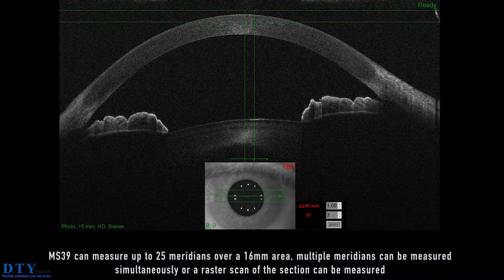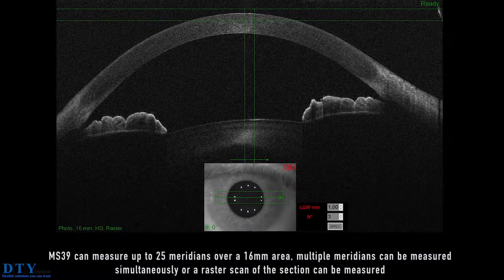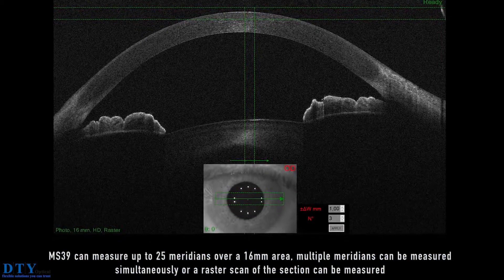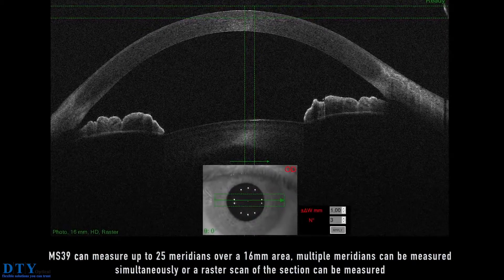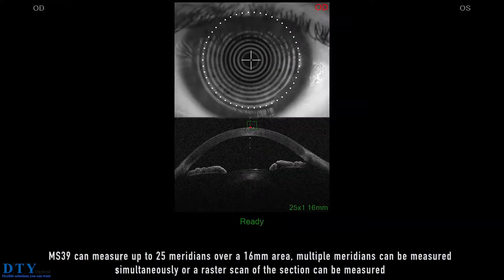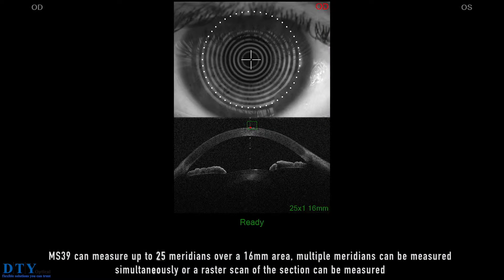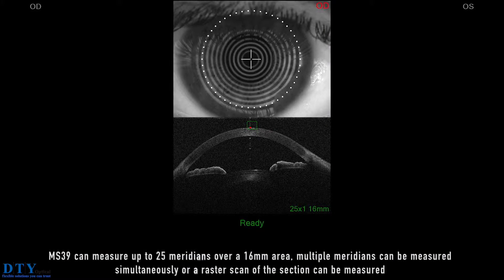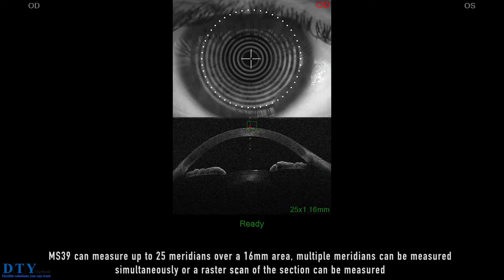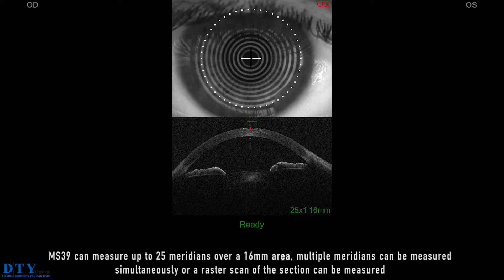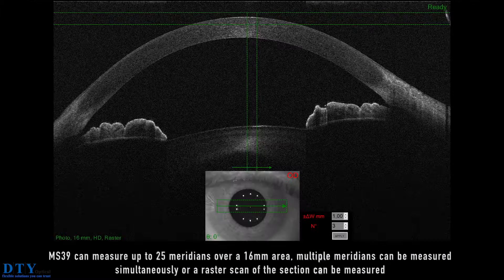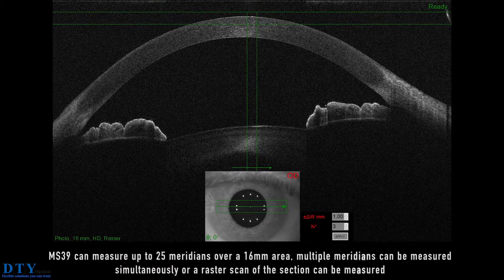MS-39 can measure up to 25 meridians over a 16 mm area. Multiple meridians can be measured simultaneously, or a raster scan of the section can be measured.